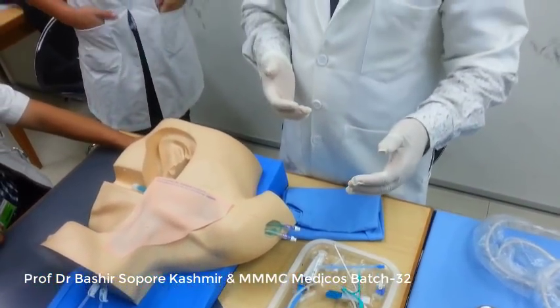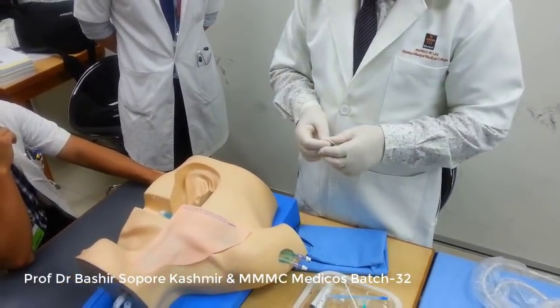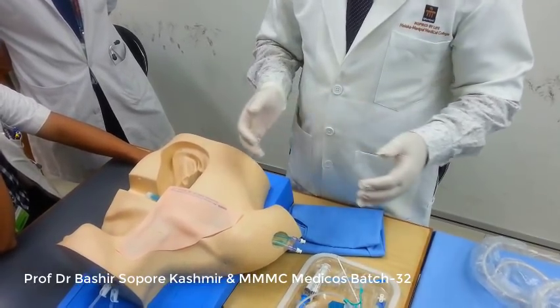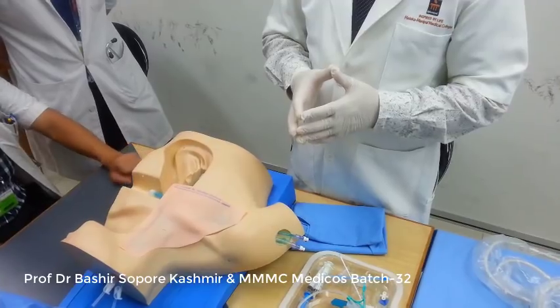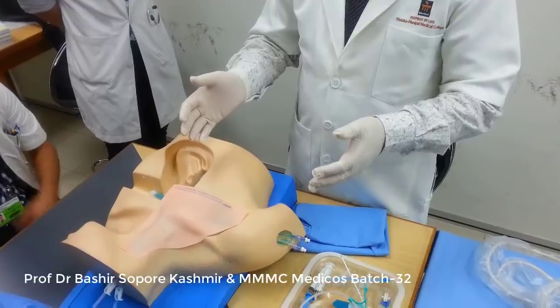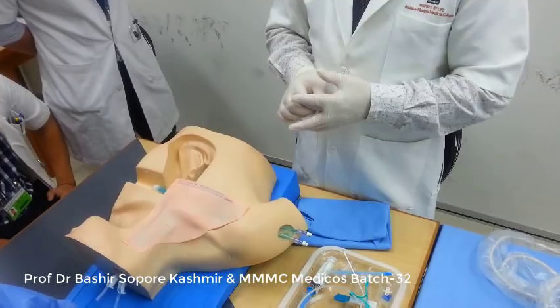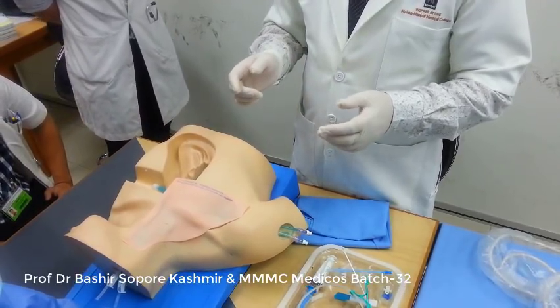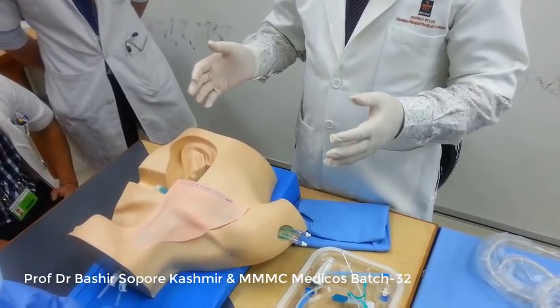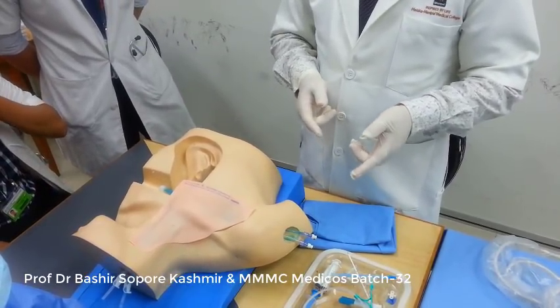some other items that are in the kit. So all this is to be checked, that you can't perform the central venous catheterization unless you check the kit properly and you see that all the tools are present there for performing the catheterization.